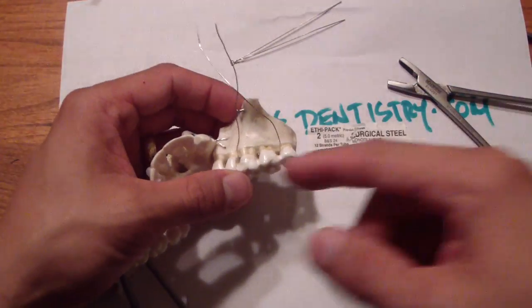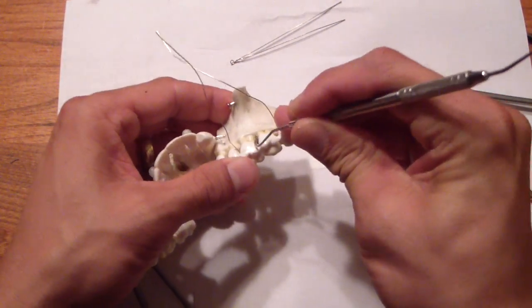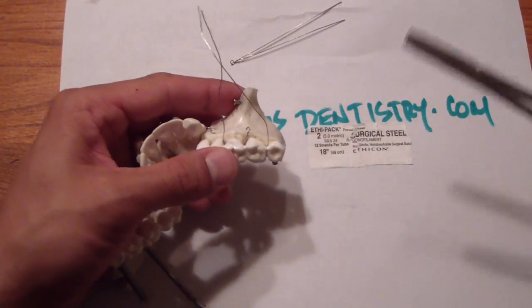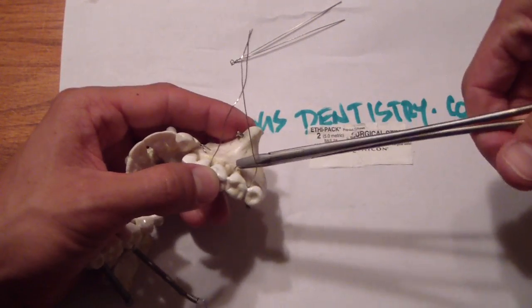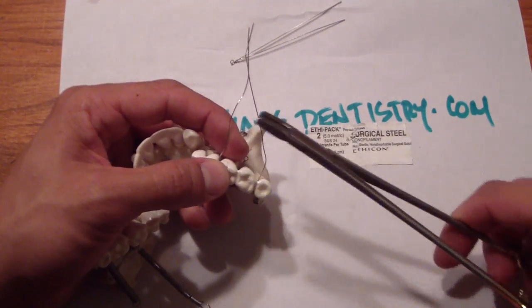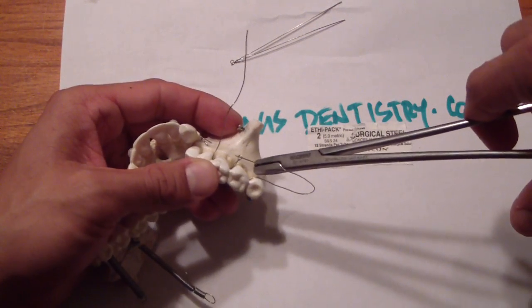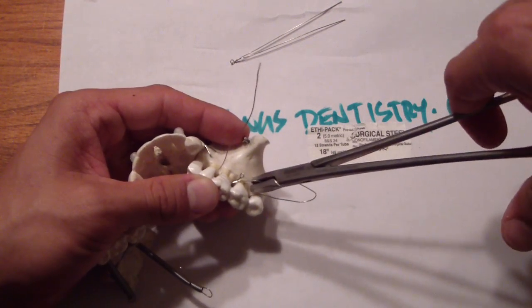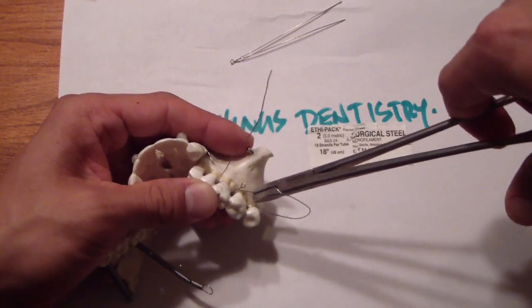There's the start — see how the loop gets pulled through. You may have to get a set of Hagar forceps to clip onto that and hold onto it, and another set of Hagar forceps. There are a few ways you can do this. We essentially want to tie a loop with the loose ends here. You can either go through the loop right here if you're having problems. But it's best if you don't go through the loop, because then you'll leave that loop to provide fixation between the maxilla and the mandible.